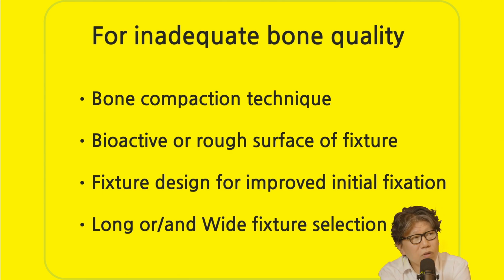I also wanted to put in a 9 millimeter fixture. There are quite a few cases like that lately, especially now that we have a lot of Mongolian patients. Korean people have a very developed maxillary sinus, so wide sinus cases are quite difficult if you don't use palatal bone anchorage. I think it would be helpful for you to study sinus geometry, and it would help you to place the implant.